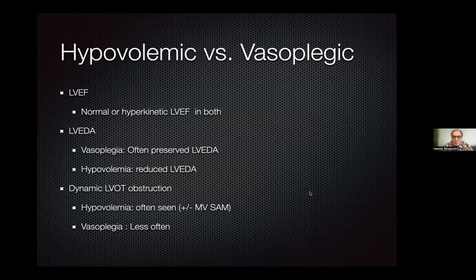But for hypovolemia, you have that kissing area that completely collapses. So the LV end diastolic area stays stable a lot of the time, but for hypovolemia it is significantly dropped. The other thing that matters here is that when you have that area stabilized, it means you barely get a problem with LV outflow tract obstruction.